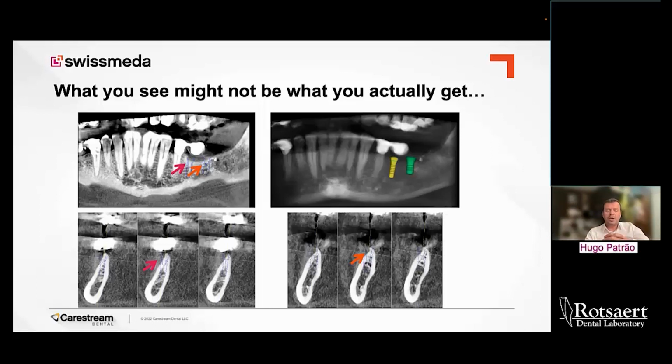That will be the start of a hell of a journey, because if on one side you are going to lose the bone, on the other one you will also lose it because the threads are exposed. Exposed threads encourage the bone to decrease, and then the gingiva would follow, and you start to have increased chances of implantitis. So this is the typical scenario that you never want to encounter. In one part too deep, in another part threads exposed.